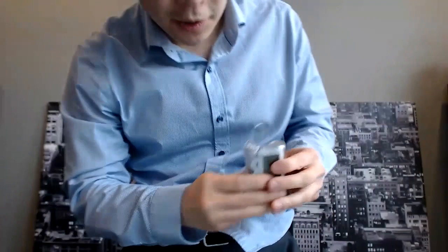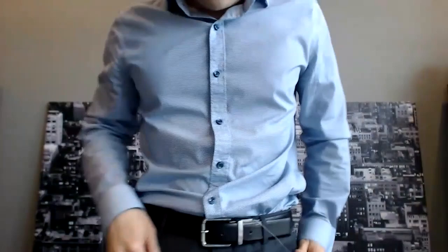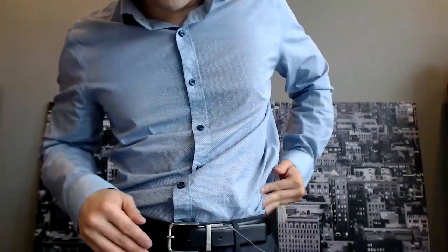So I just tuck my shirt in, put it in my pocket. And as soon as I put it in my pocket, it comes out sort of discreet. I guess you can see this tube here, but if I put it closer over here, it's actually pretty discreet. You might not notice it. And yeah, so then you can program this to do bolus insulin. There's a bolus wizard calculation similar to the insulin pumps. You can set different infusion rates at different times.